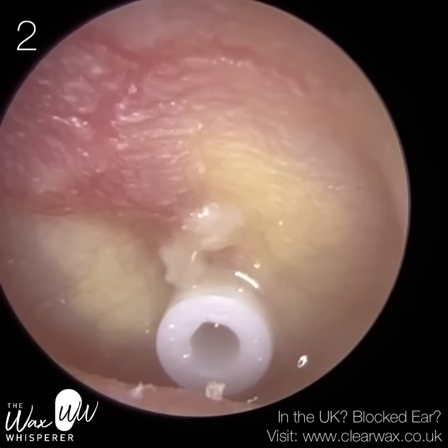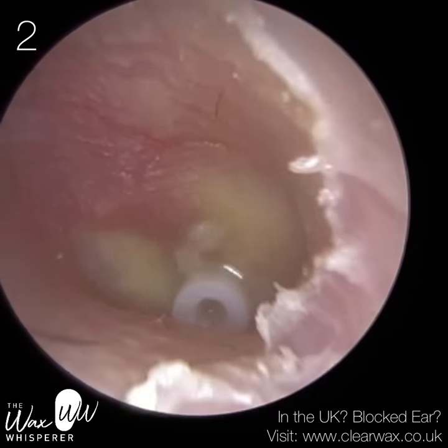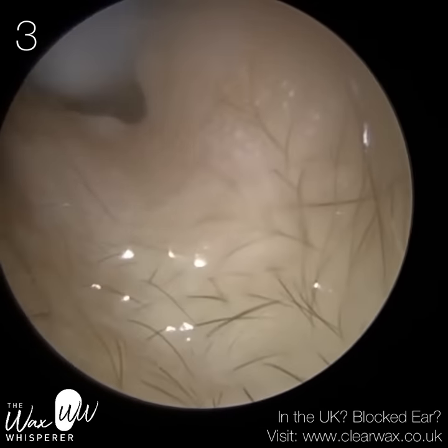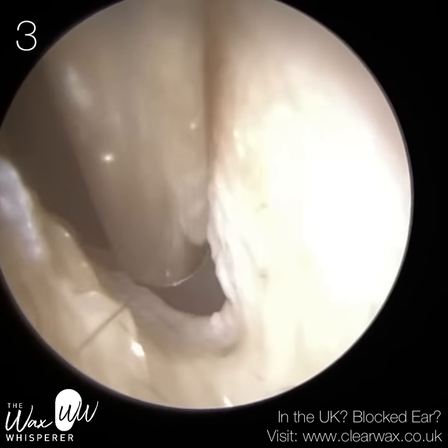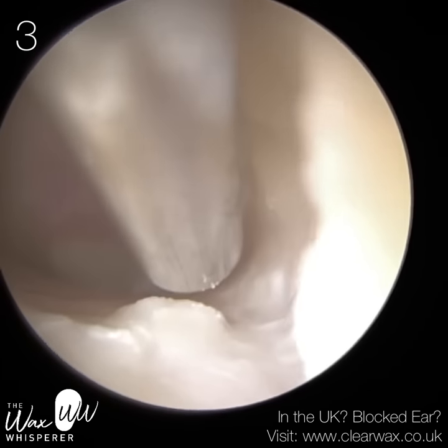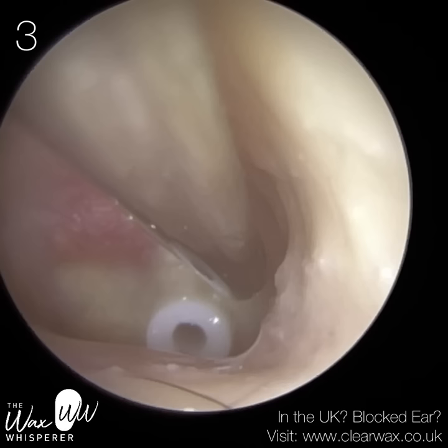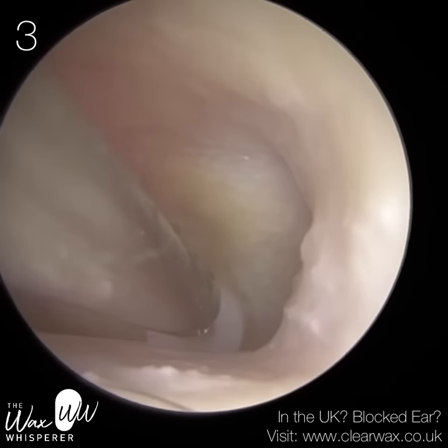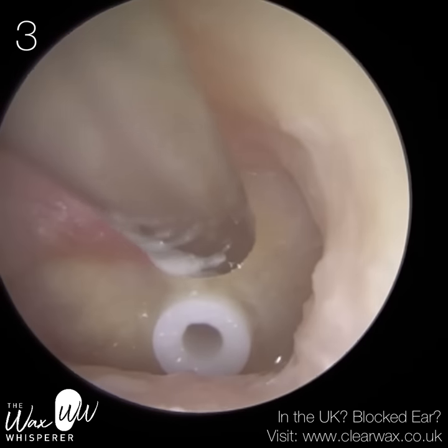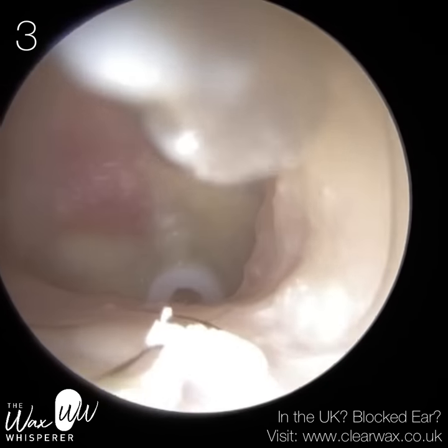My auntie had grommets fitted back in 2018. This is appointment three — her ear was still discharging, and it's been a week that she's been using the oral antibiotics with minimal change in symptoms. When I examined the ear, there was less discharge. I'm trying to remove some of this soft, wet skin at the canal entrance and now going towards the eardrum. Please do watch — you're going to see some really interesting things going on in the next 10 to 15 minutes.